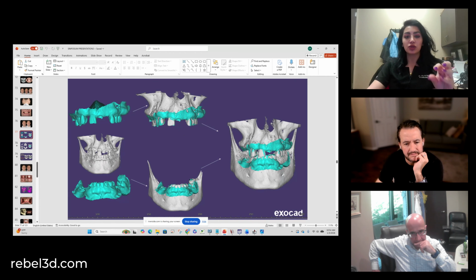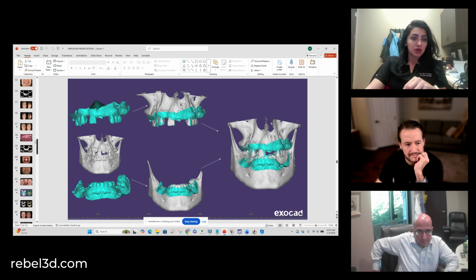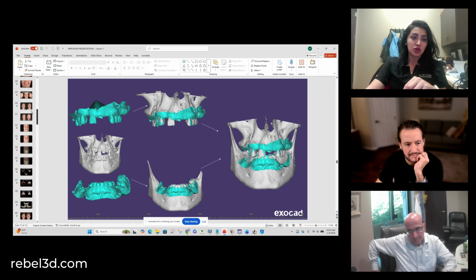So you're taking those two separate jaws from the DICOM and then segmenting them into STLs, right? You're merging the individual intraoral STLs to the segmented skulls, the individual jaws, and taking those and merging them to the bite that you took at the desired vertical dimension. So this is essentially what you want. You don't want to rely on the bite that you're getting from your intraoral scanner, and I'll show you why. There are many examples why we don't like that. They come with so many inaccuracies.